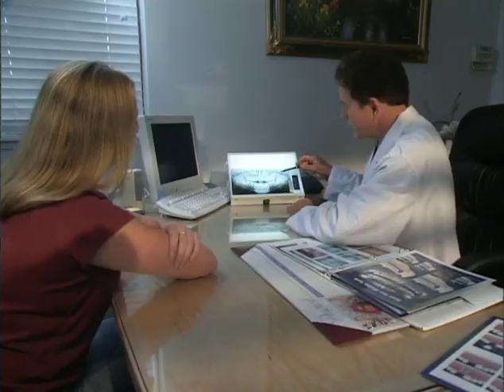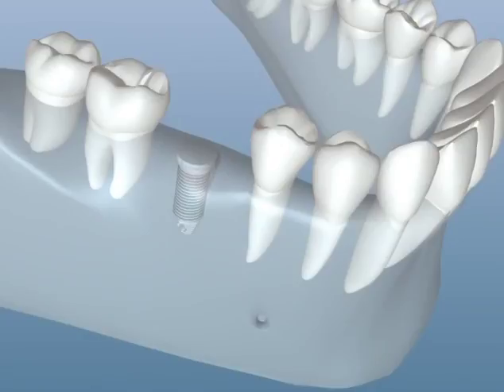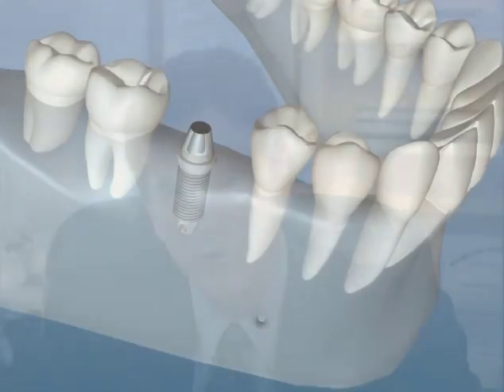Now, several months after the initial surgery, when the implants are securely joined to the bone, we conduct the second procedure. During this second procedure, an incision is made in the gum to uncover the top of the implant, and a healing post is attached. The healing post protrudes from the gum, which requires some adjustment of the denture or the bridge that rests on top of it. The patient's dentist will adjust the dental appliance to accommodate the post during the healing period.